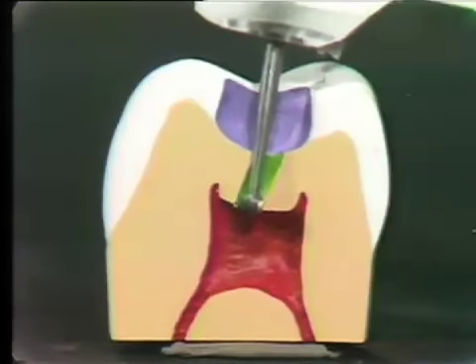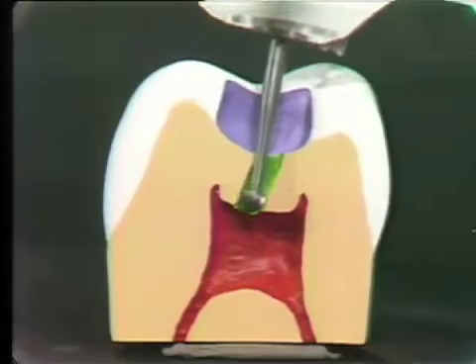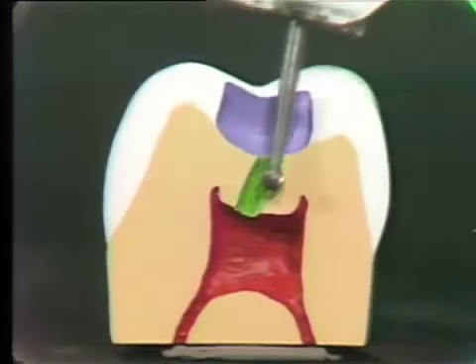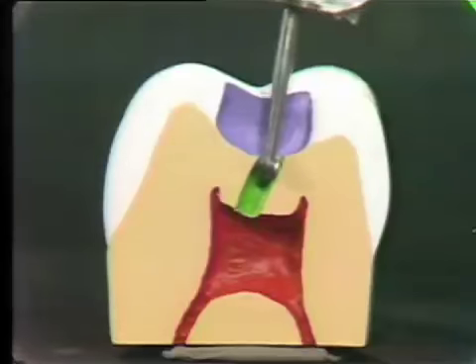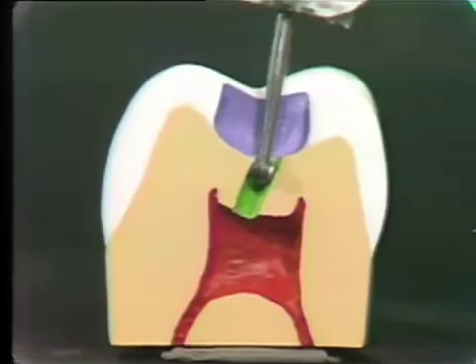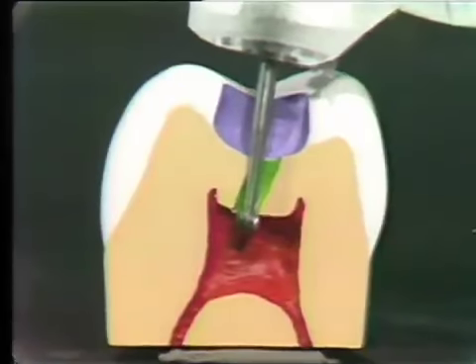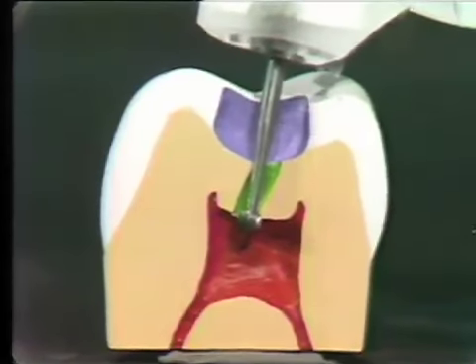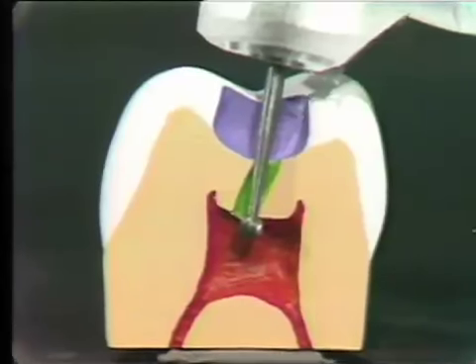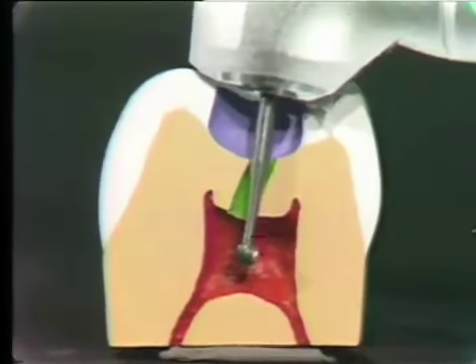Once again, on these molars, the pulp can be a far distance away, so don't be nervous and start looking around for it blindly. Angulate the handpiece, center it over the central pit. The pulp will be underneath the central pit, and dive straight down to it. When you reach the pulp, you'll feel a burr drop in and stop your handpiece. You don't want to continue on and hit the bifurcation.